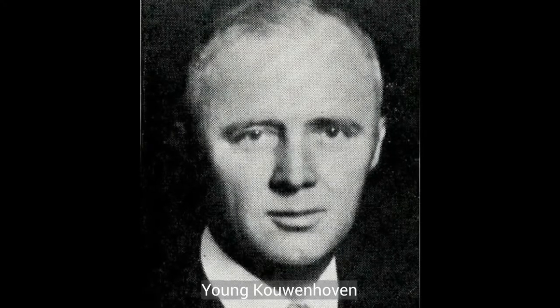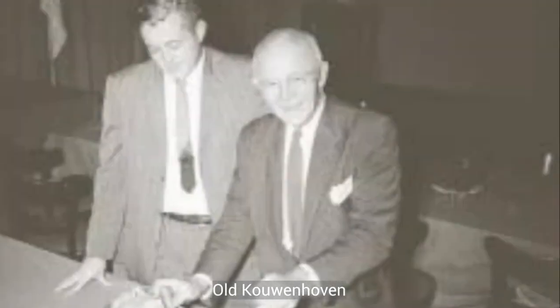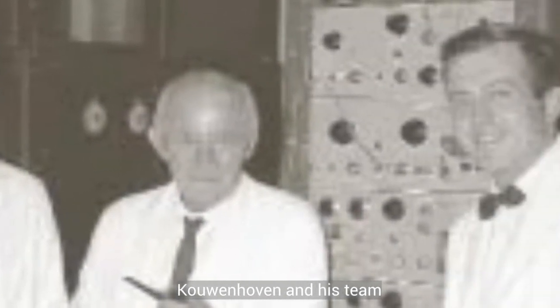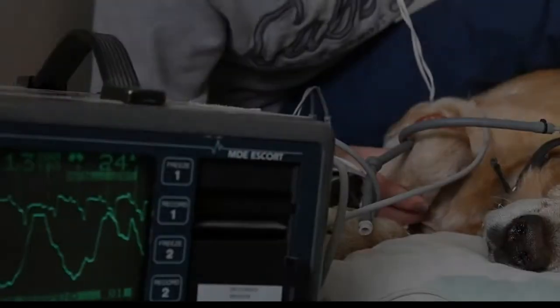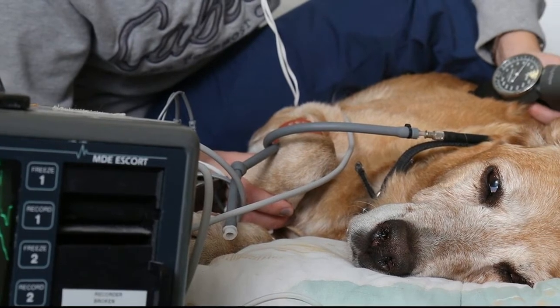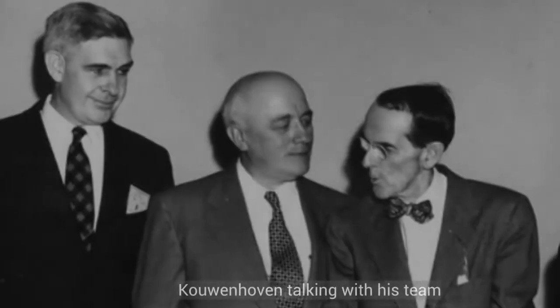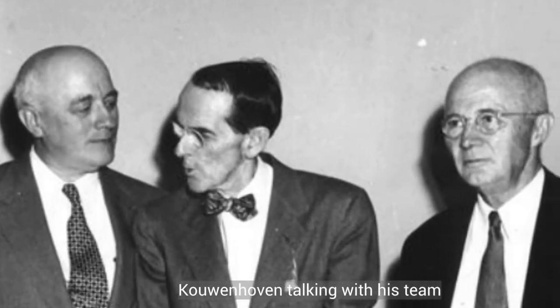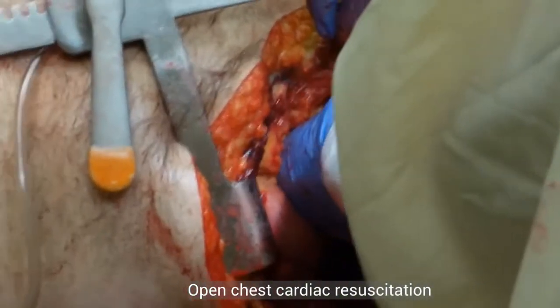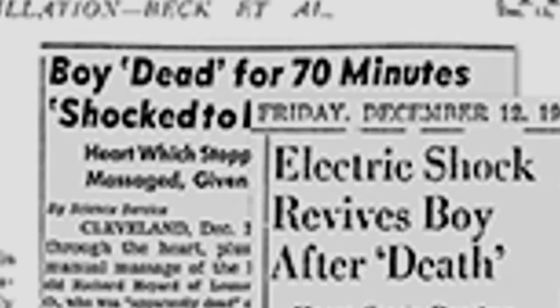In 1933, a young engineer named William Kouwenhoven accidentally discovered that small electric charges can restore a heart's normal rhythm. Kouwenhoven and his team at Johns Hopkins University were applying surges of electricity to a dog's heart, and on the second shock, the dog's fibrillating heart was restored to a normal rhythm. This was the first known case of electrical charges reviving a fibrillating heart. From 1933 to 1947, Kouwenhoven and his team worked at trying to use this technique during open chest cardiac resuscitation, research that eventually led to the famous case of a defibrillator saving the 14-year-old boy in 1947.